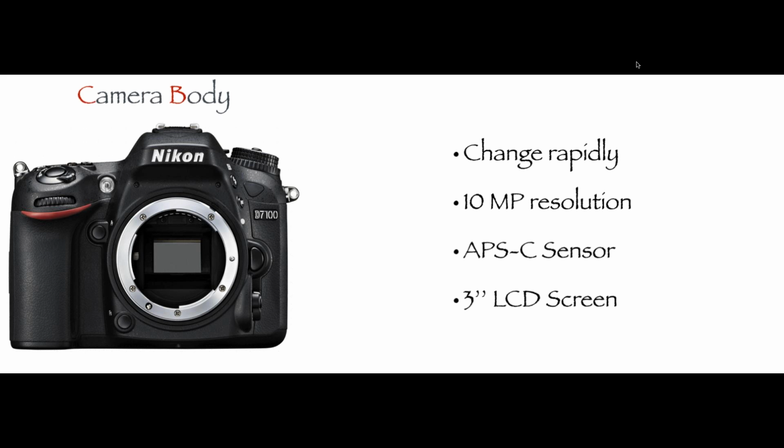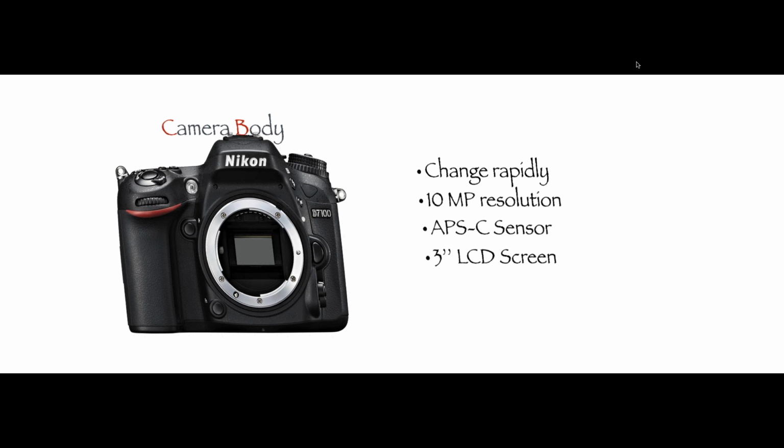You can buy, like myself, a D3200 Nikon. It's an old camera. It's a basic body, but it does high quality photos. I don't need to have a lot of functions in my camera, because that camera I specifically use only for my dental practice.